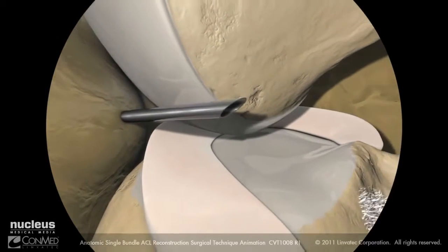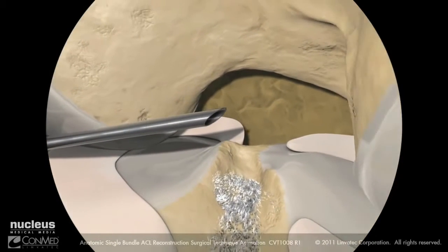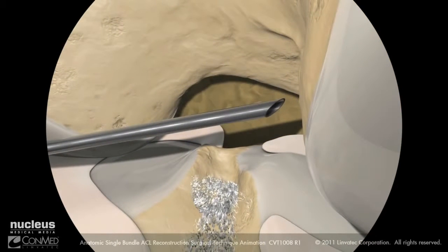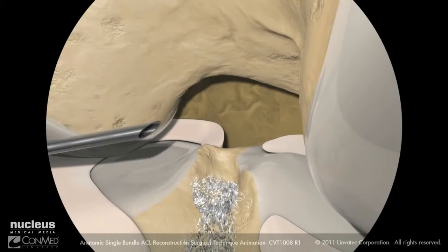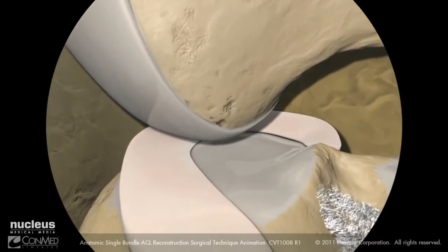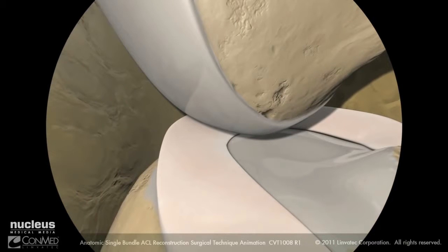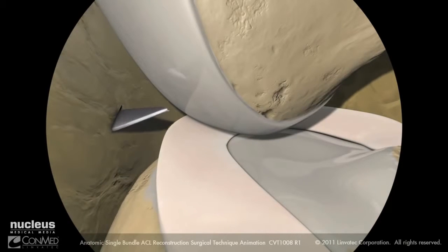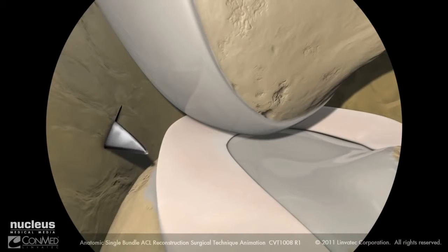Advance the needle to confirm access to the femoral footprint of the ACL. Using an 11 blade, incise the skin making sure to orient the blade away from the femoral condyle to prevent damaging the articular surface.